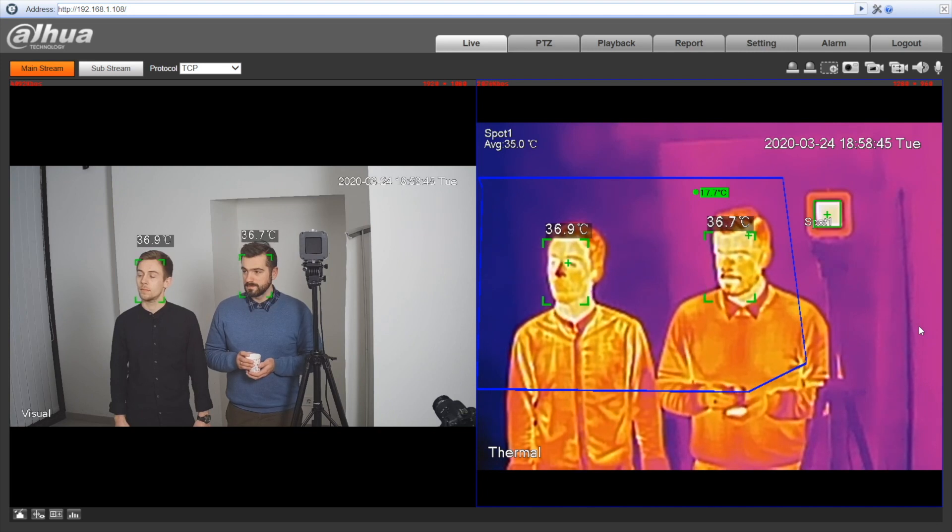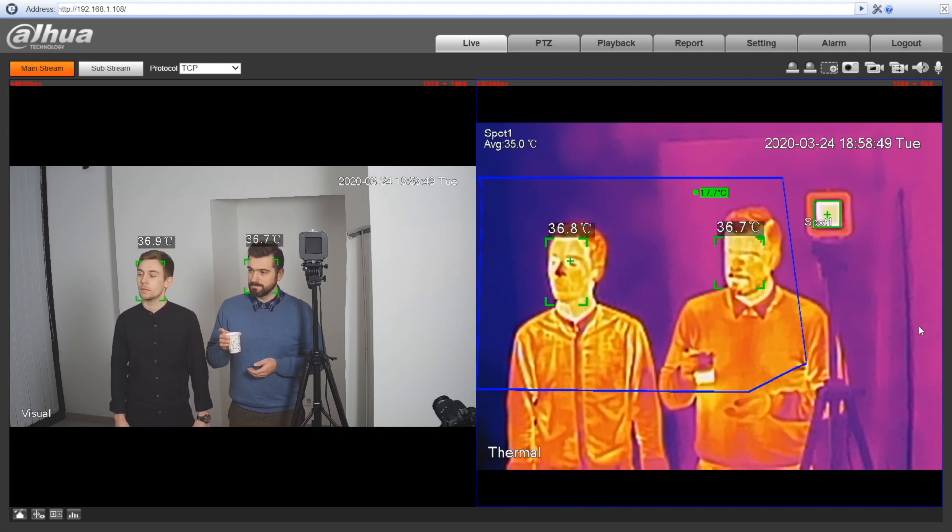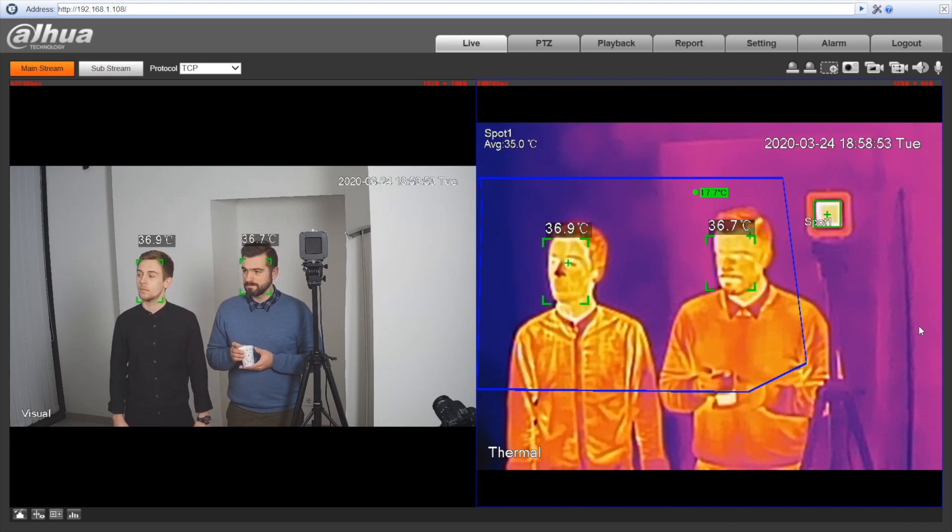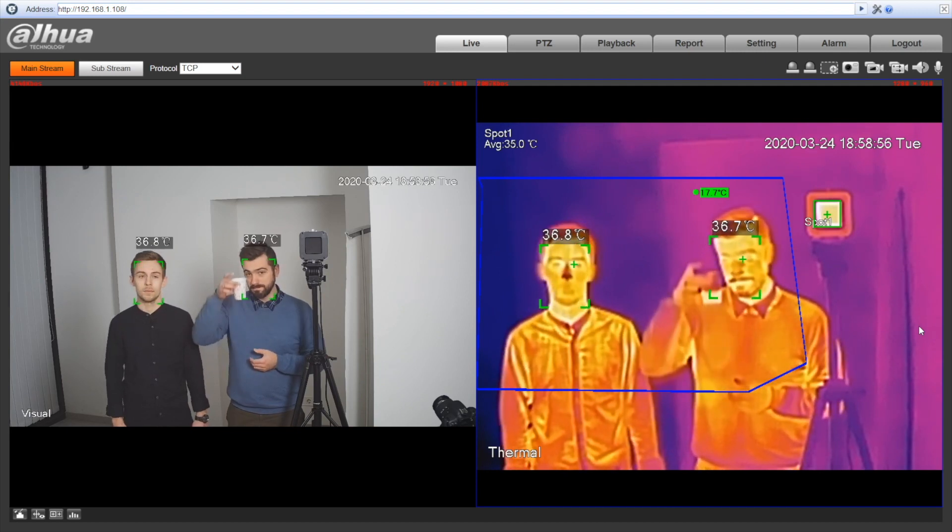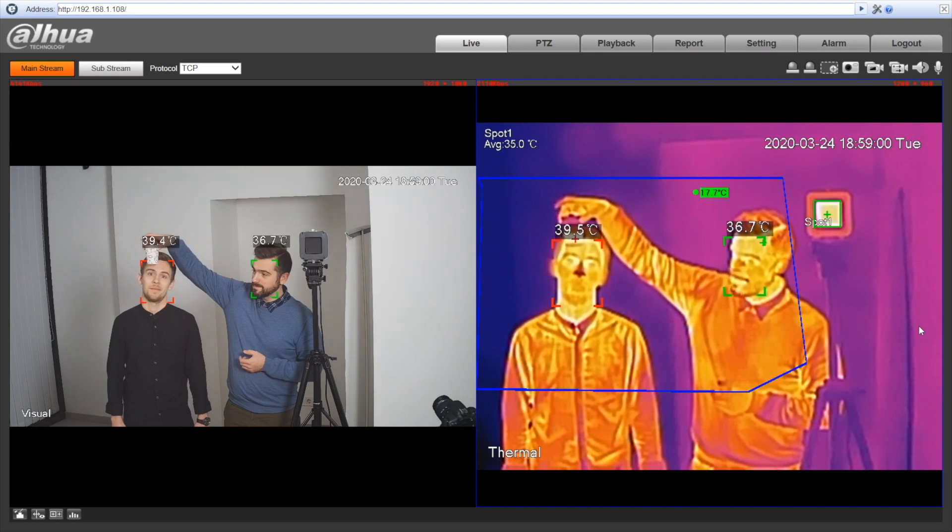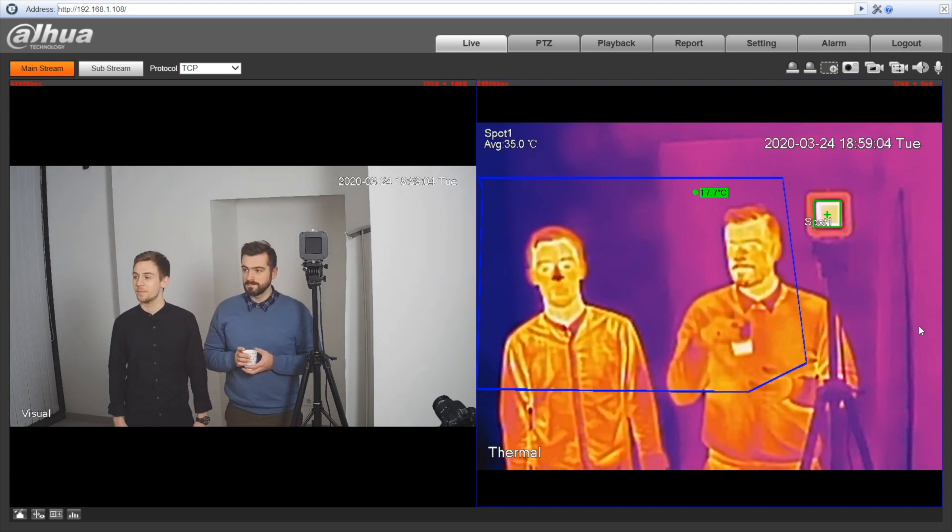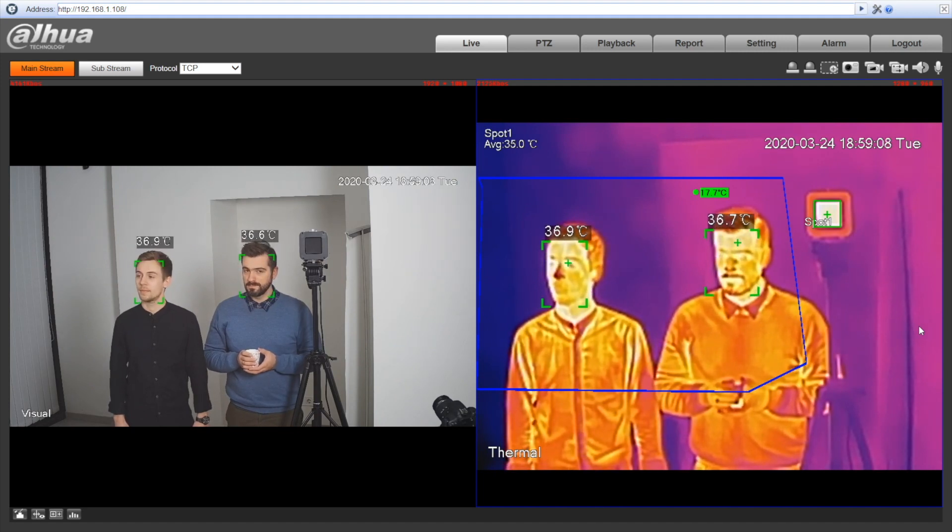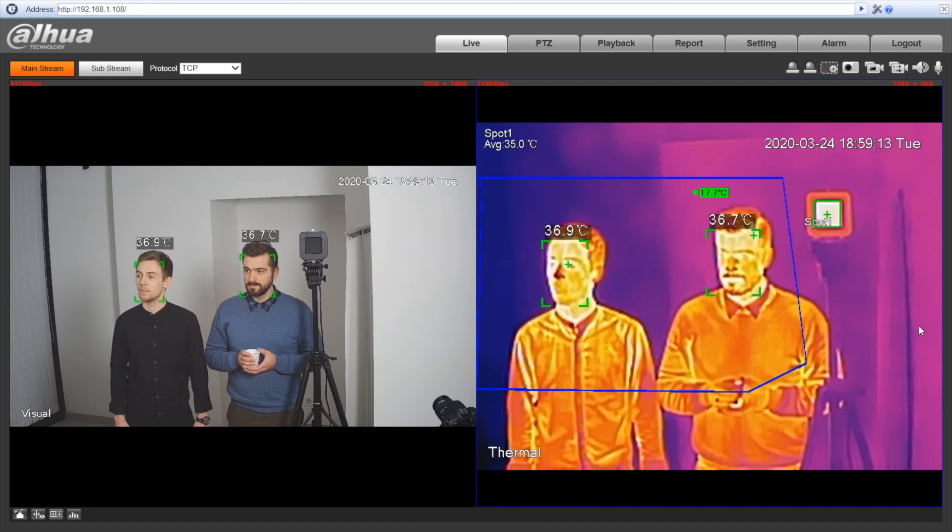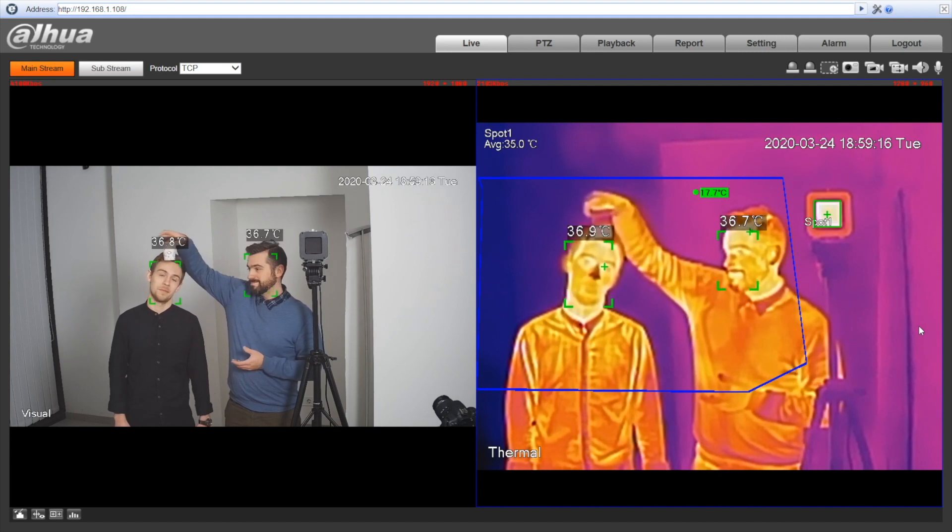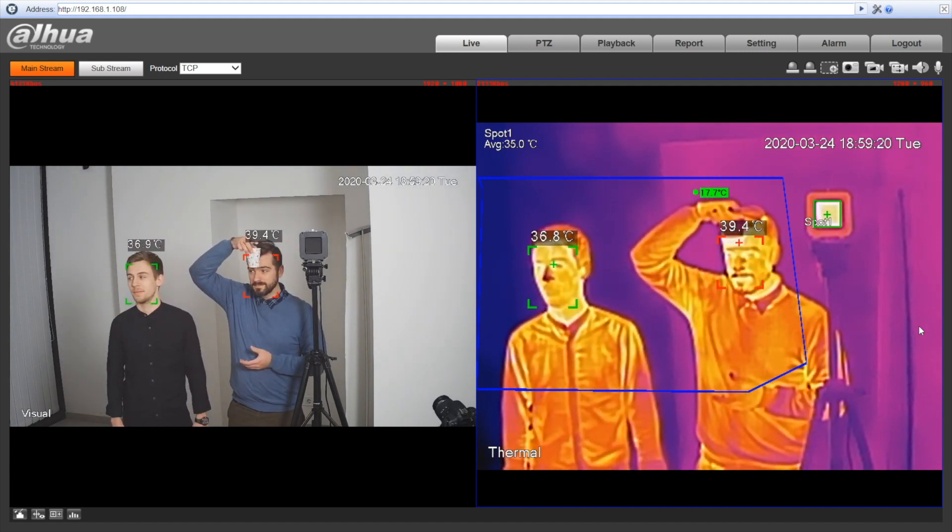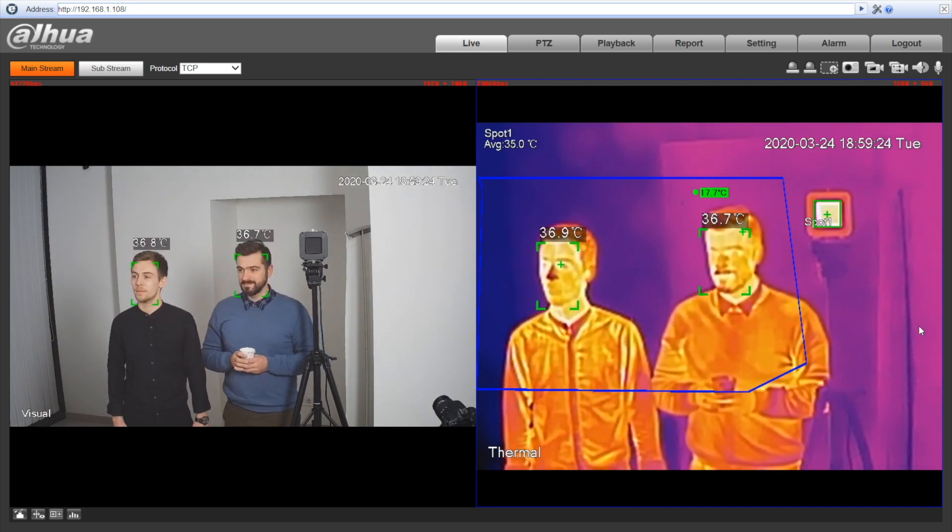And also, you can see that my colleague number two has a hot liquid, which is a coffee in his hand. So I've asked him to do this. And this leads us to one conclusion, that the measurement area is only faces, only faces. Like only the faces area, these squares, these rectangles. And this is how the technology works.